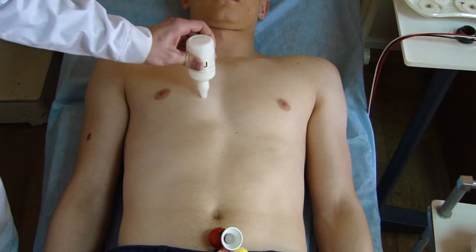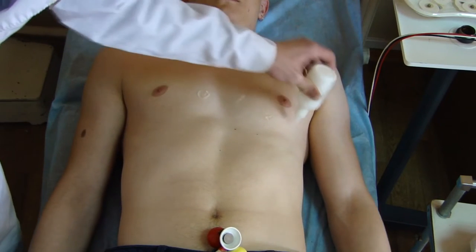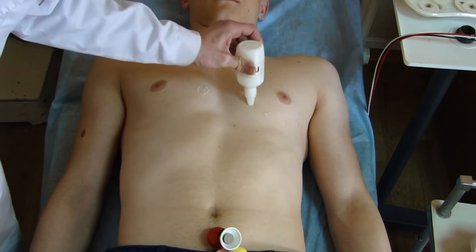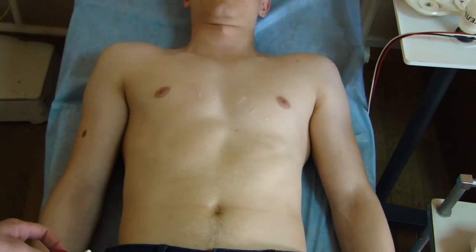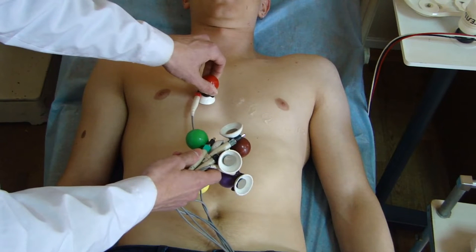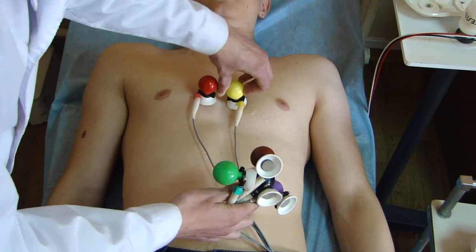We use gel again for setting the chest leads. Procedure for applying chest electrodes: First electrode – red, placed in the fourth intercostal space along the right edge of the sternum. Second electrode – yellow, fourth intercostal space along the left edge of the sternum.